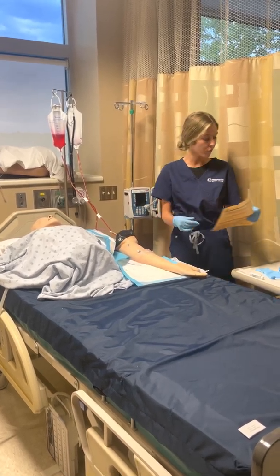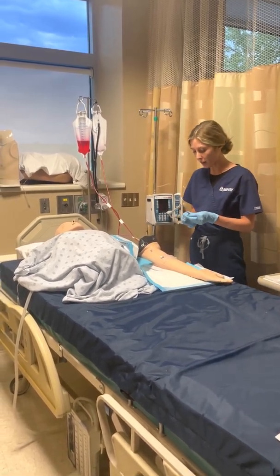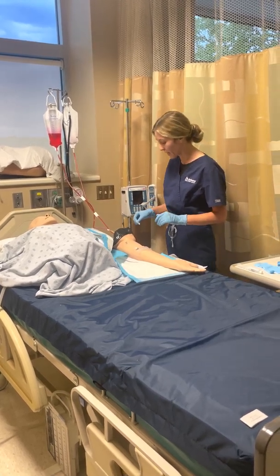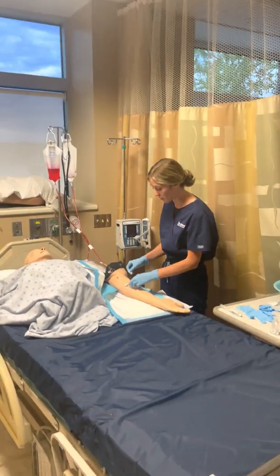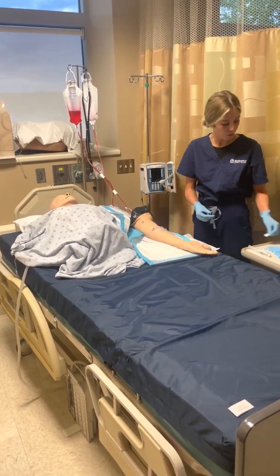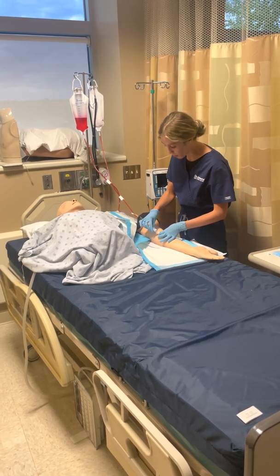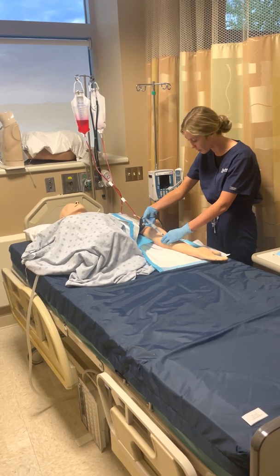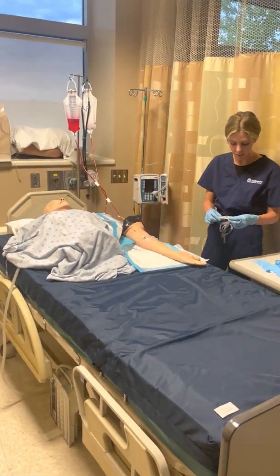Okay. Perfect. So before we get started, it looks like you do have an IV established already. It looks like there is a 20 gauge needle in there, which is perfect. We need between 18 and 22 for blood transfusions. So I'm just going to check the patency of the line, to make sure there are no occlusions or clogs in here that would hinder the blood transfusion process, okay? This is just some normal saline that I'm going to grab and put in here, and make sure that everything looks clear and good to go. Great, that looks good. I don't see any occlusions or any concerns.